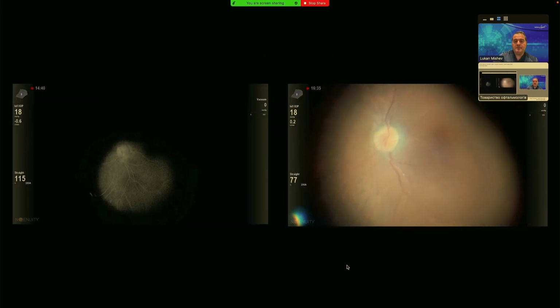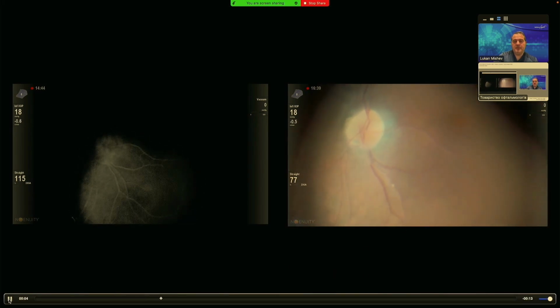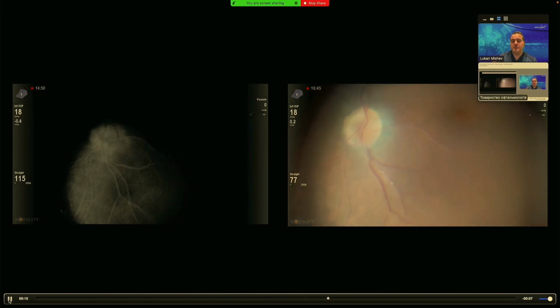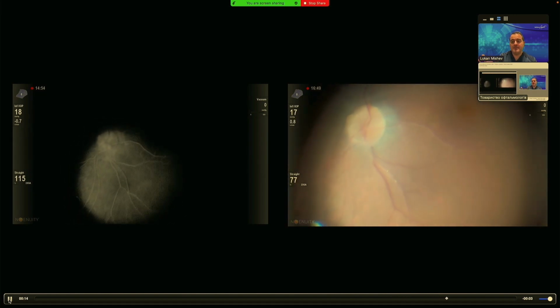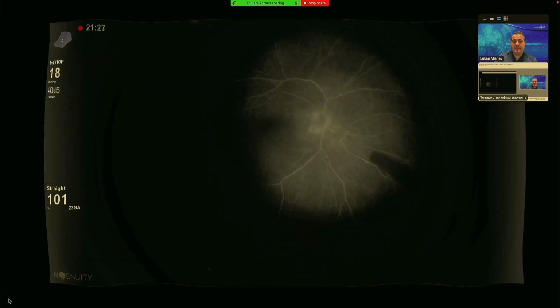This is a brief case in which we saw something like an embolus in one of the vessels, and we were wondering if this is an occlusion or whether there is a perfusion. The intraoperative fluorescein angio showed us that there is no interruption in the blood flow, meaning that these are arteriosclerotic plaques but not emboli. So again, it's a decision-making tool.